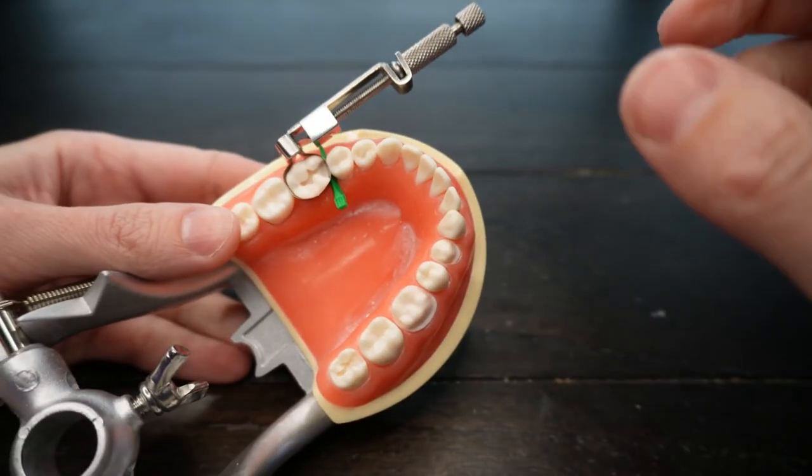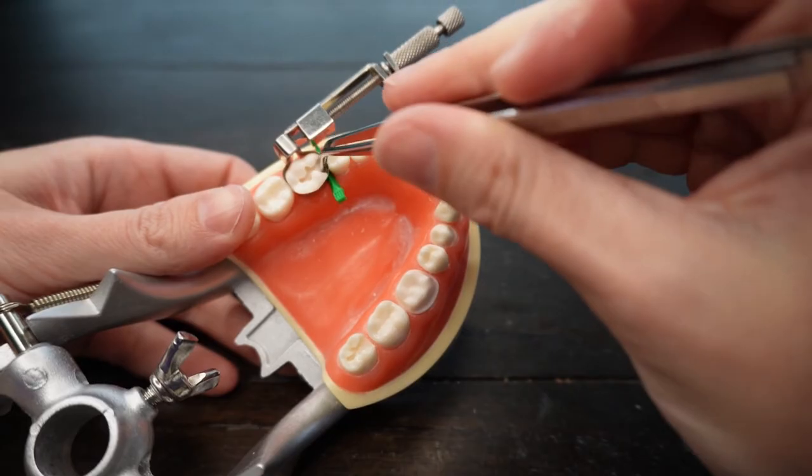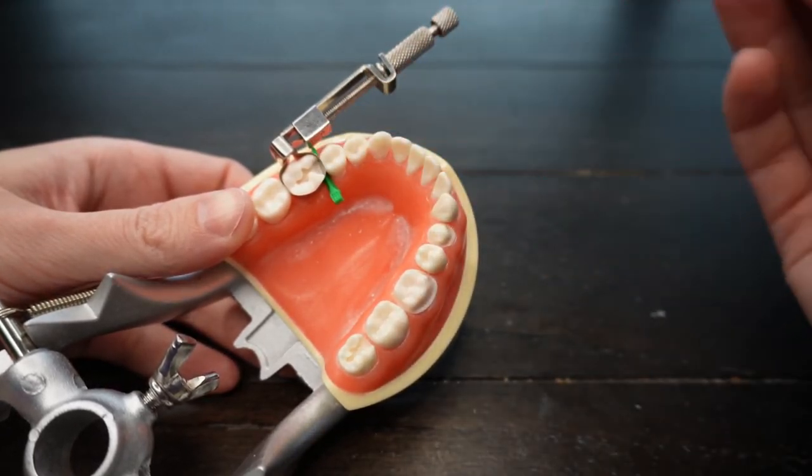I cannot see any pink. That means my filling will be good. I have a good contact because this is touching this adjacent tooth. And there is no pink gingiva.